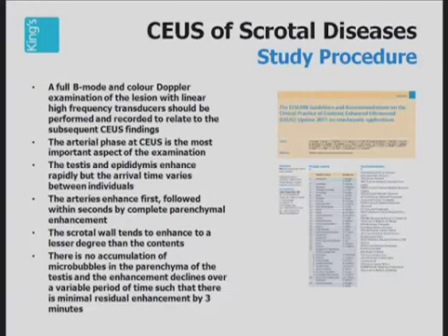The physics of the microbubble does not allow high frequency probes to adequately visualize the microbubbles. You need a higher dose than you would normally use in the liver. Those of you who are familiar with the drug that is predominantly used in Europe, SonoVue, will know that for liver lesions you are injecting a dose of 2.4 mils, but for the testes you would need to inject 4.8 mils to get adequate visualization. This is not of concern.